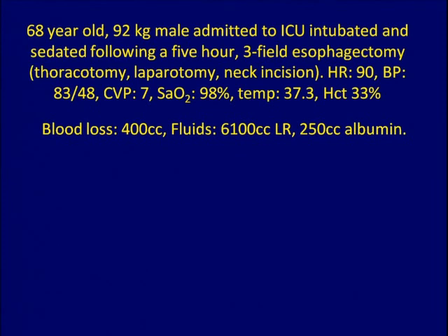Now, we started using the NICOM a few years ago when we were doing open esophagectomies. Large incision in the chest, open laparotomy for an extended period of time where you're losing 10 or 12 cc's per kilo per hour of fluid, a large volume loss, and the neck anastomosis. And we began to notice a number of different things. This, for example, is a patient who had a procedure done. It was the standard, what we call a 3-field esophagectomy.